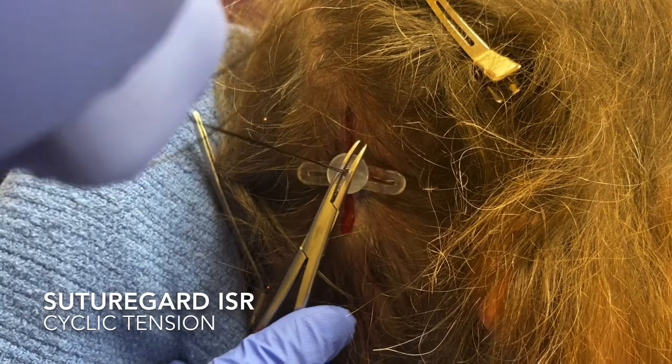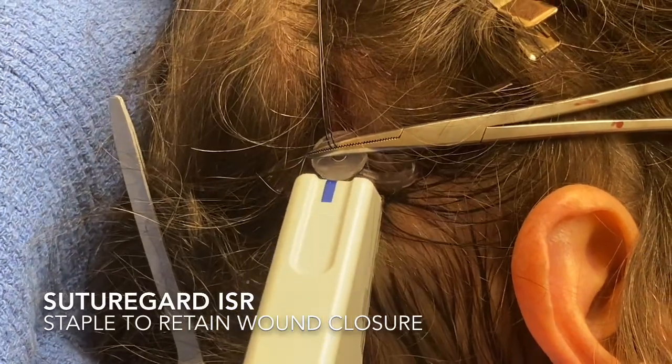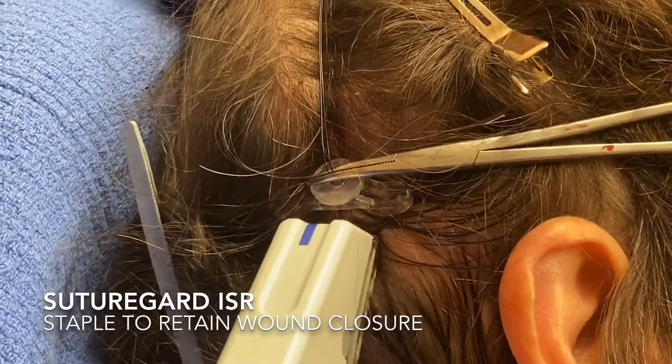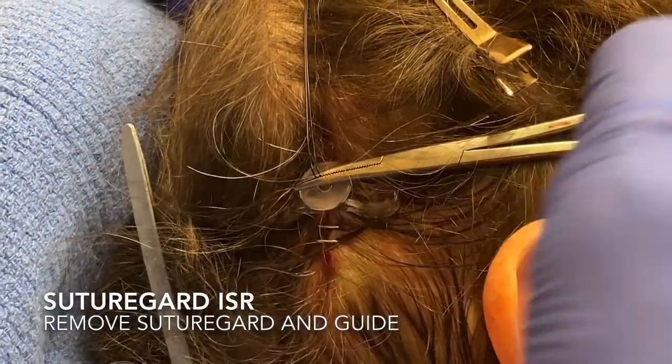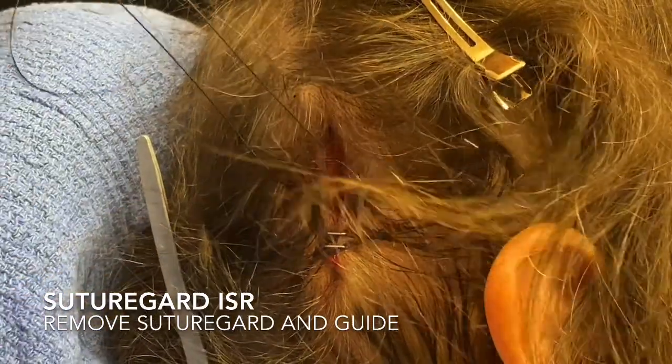Once I think I have adequate closure and I'm ready to close, I'll put a staple on either side of the wound just to keep it closed and retain that wound closure. Then I'll remove SutureGuard.